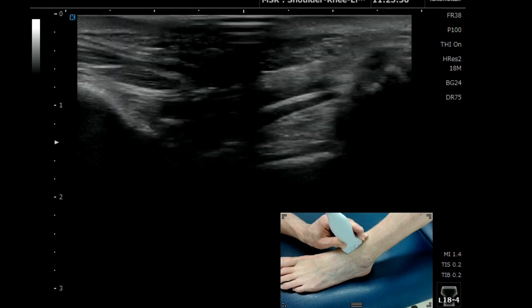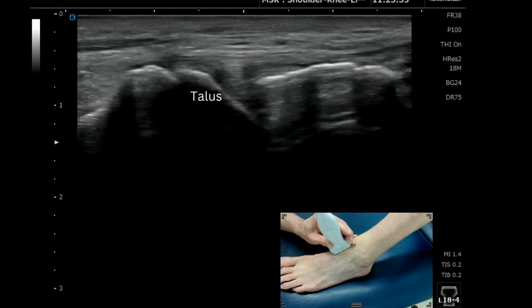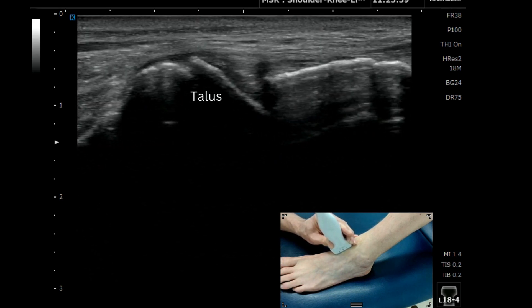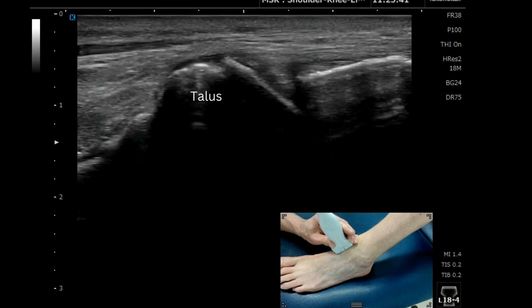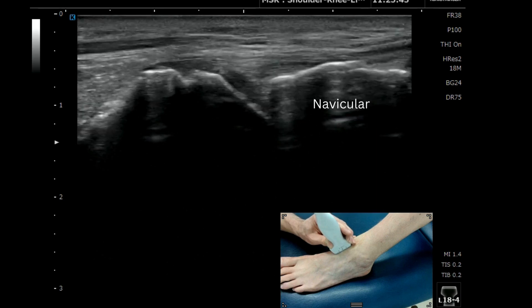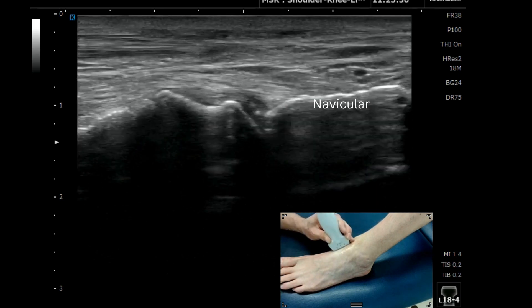If we move down a little bit more distally, we come across that V-shaped gap between the bones, which is your talonavicular joint. You've got the talus on the left and the navicular on the right. You can double check that that's the articulation you want as you come across medially.